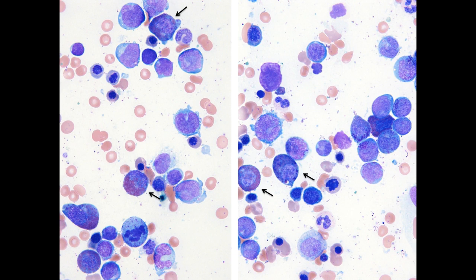So there are erythroid precursors, some blasts that have more immature chromatin, such as this, some of which have folded nuclei that make you think about monoblasts, but particularly conspicuous are these cells with eosinophilic granules, and some of these cells with eosinophilic granules have these coarse, densely basophilic granules.